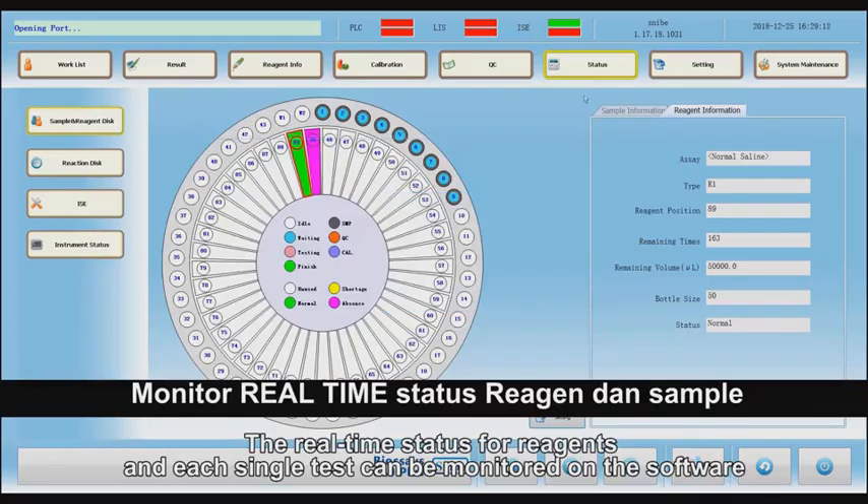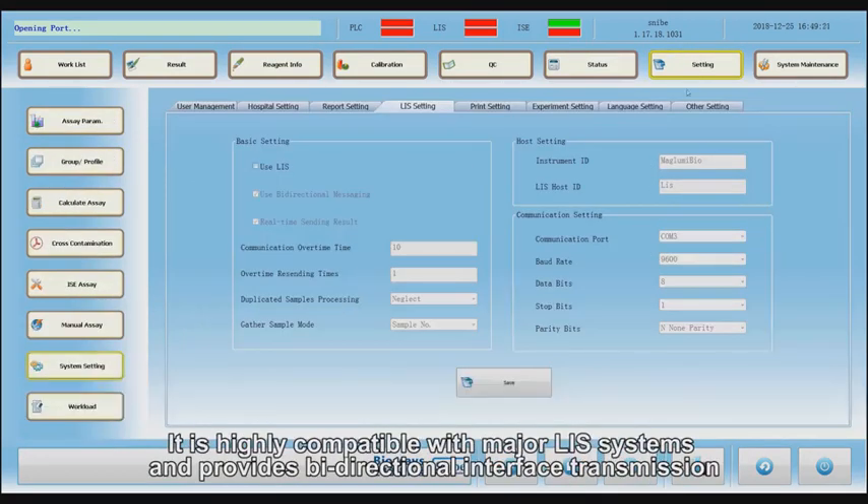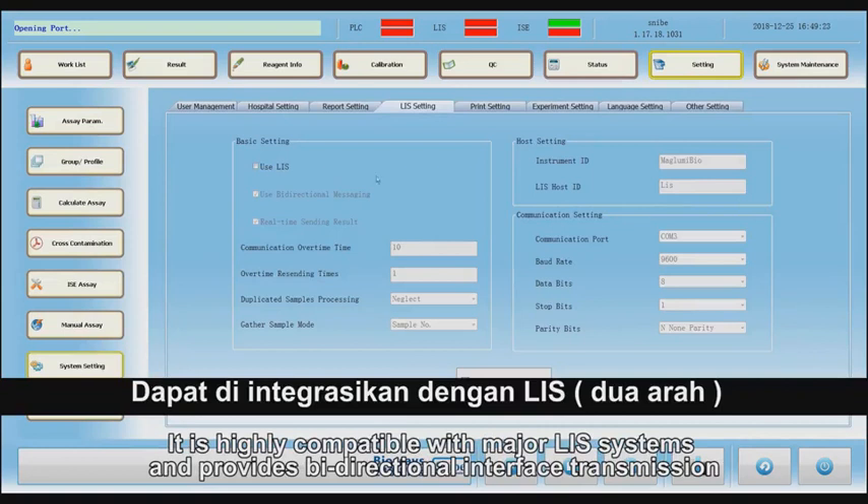The real-time status for reagents in each single test can be monitored on the software. It is highly compatible with major LIS systems and provides bi-directional interface transmission.